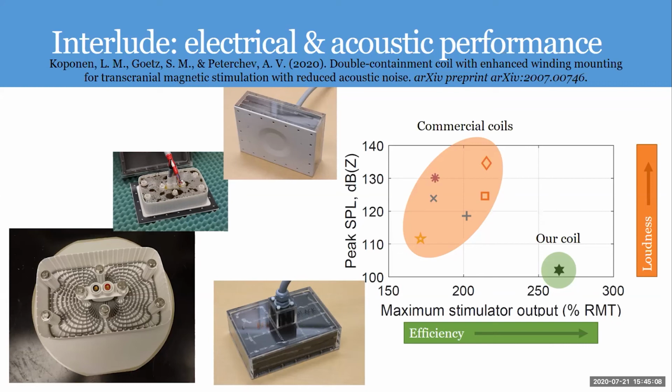Lari, I have a question. What about placing the coil inside a vacuum chamber? So you think that would be reasonable? So yeah, if you can do a vacuum chamber where you mount the coil so that the coil mounting doesn't leak sound, it would be perfectly quiet, but you need medium to high vacuum to actually suppress the sound.